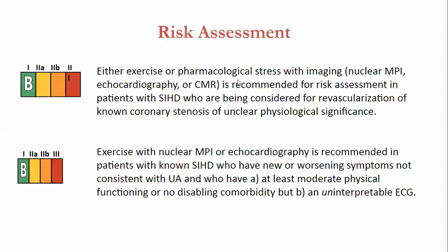Okay, you can do it for risk assessment as well. In stable ischemic heart disease, a patient who has undergone PCI 5 years back or CABG 5 years back, and you now want to stratify them as to whether there is ischemia or not, then in such patients you can also use MPS for risk stratification.